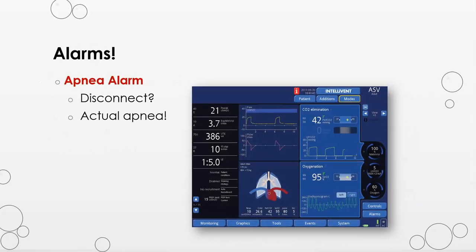Okay. The apnea alarm probably should have been first. The apnea alarm is pretty important. You will be running to respond to this one. It is pretty high pitched, so if the apnea alarm goes off, you need to run.